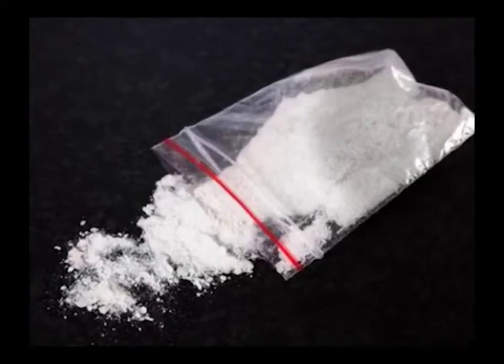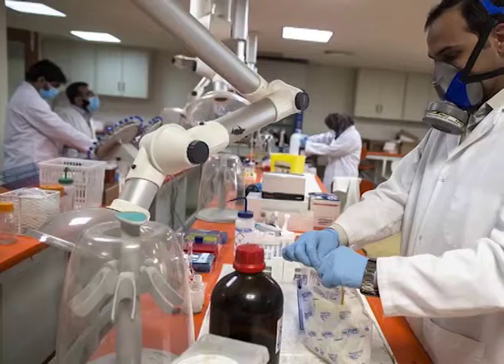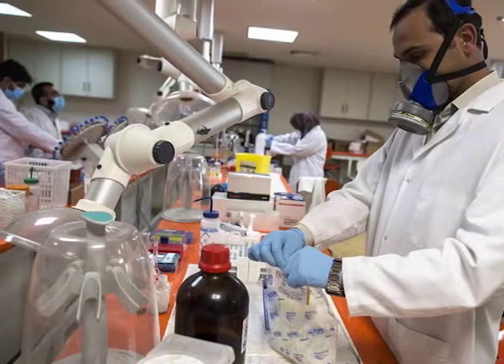Sampling methods. The principal reason for a sampling procedure is to produce a correct and meaningful chemical analysis, because most methods, qualitative or quantitative, used in forensic science laboratories for the examination of drugs require very small quantities of material. It is vital that this small quantity be entirely representative of the bulk from which it has been drawn. Sampling should be undertaken to conform to the principles of analytical chemistry.